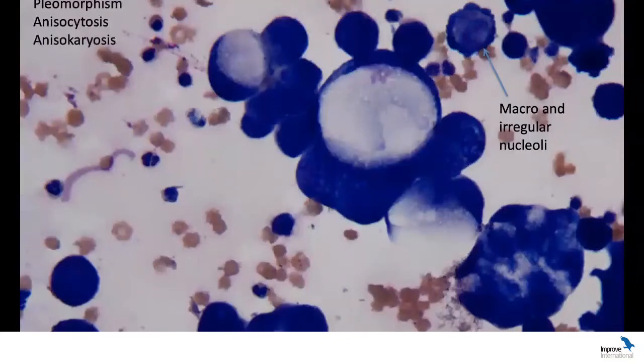Again, more examples with lots of pleomorphism. I love my Mickey Mouse cell here with the two little ears and the big vacuole, making that one a signet ring cell as well. Again, we have those nucleoli that are not just big, but irregular in shape, not rounded, giving another criterion of malignancy. Again, lots of criteria for malignancy, and of the strong kind. So we have nucleoli of different numbers between the cells, different sizes, different shapes, and those really big nucleoli.